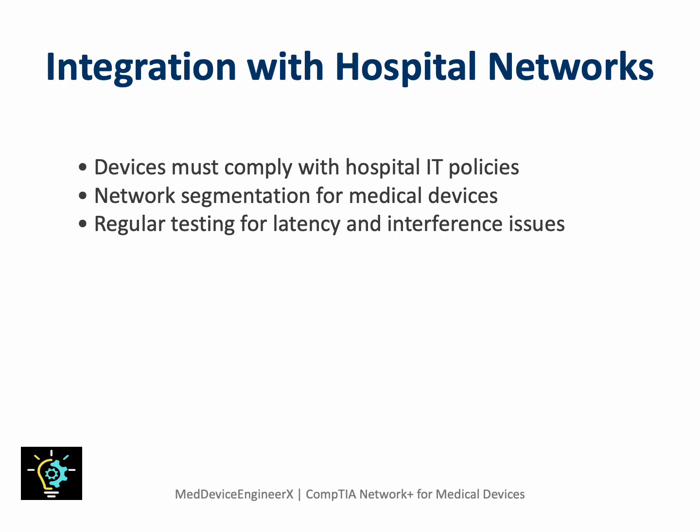Integrating medical devices with hospital networks requires collaboration between clinical engineers and IT teams. Network segmentation is crucial. Keeping medical devices isolated from general hospital traffic prevents interference and reduces cyber risks.